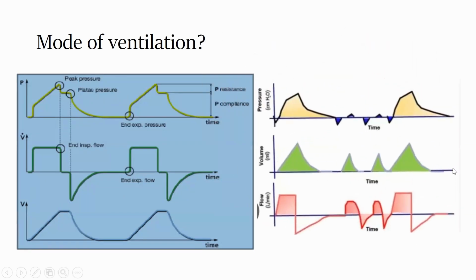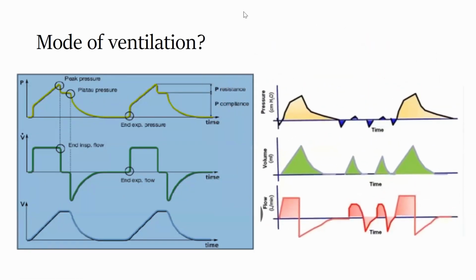What about this one? I think this one is a bit different. Can anyone try this one? Of course, it's a volume control, but what's the difference? It's volume controlled. Thank you. So this one is volume controlled, but what type? Is that AC, SIMV?